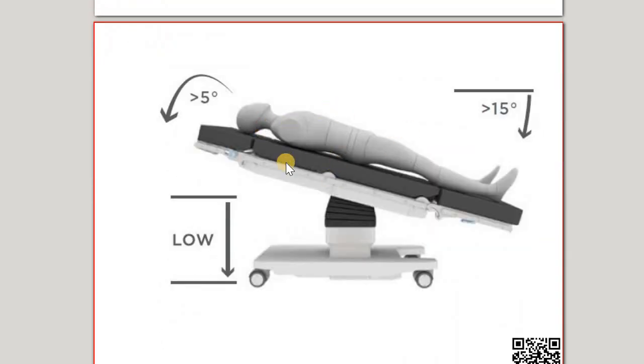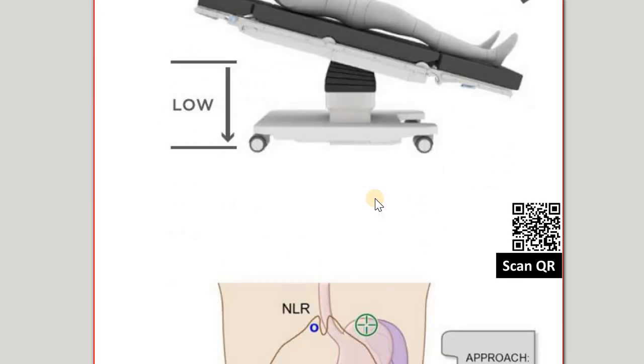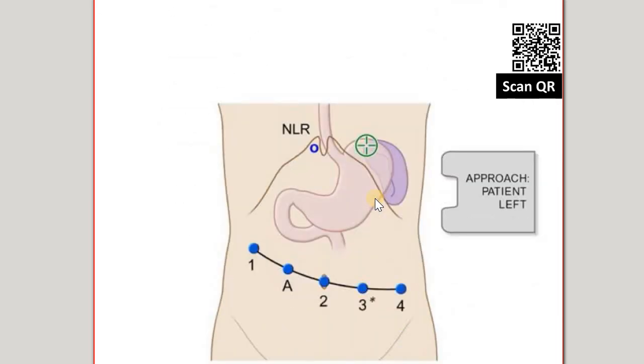So see, this is how the patient is asleep on the table, and this is just one of the figures which shows the plan of operation, as I told you. So there will be various types of incisions, cuts, and other types, and this is the place of our interest.